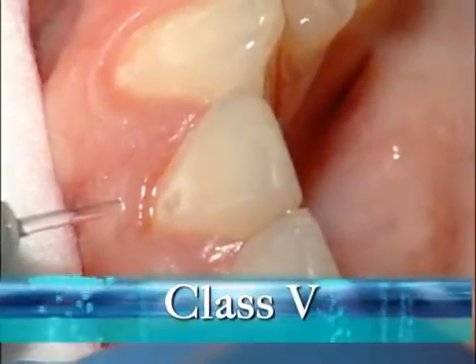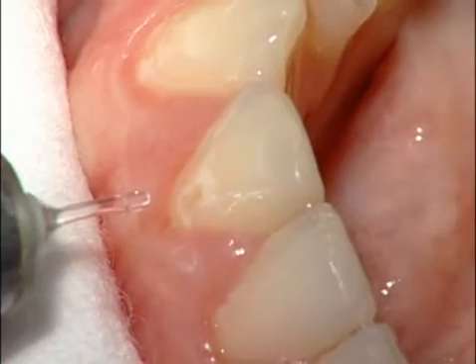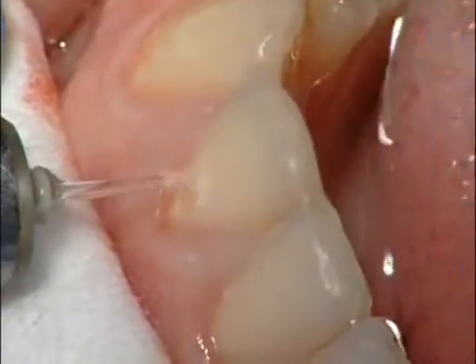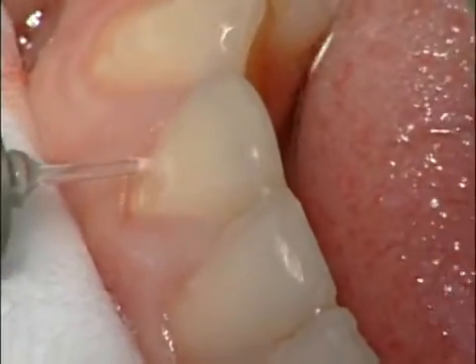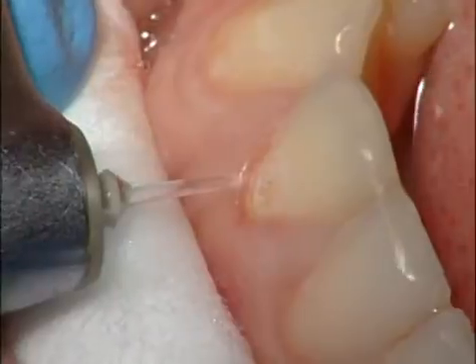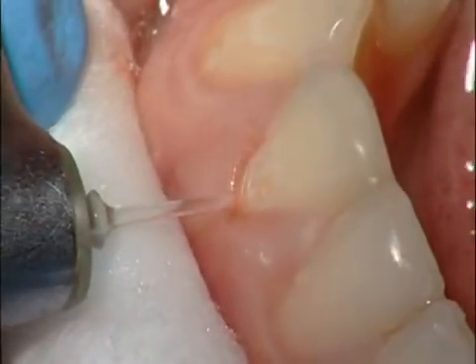Here we have a class 5 cavity without an existing composite on a fairly small thin enameled tooth. I would start this at 4 watts at 15 to 30 hertz with a T4 or a G6 tip, 20 to 50% water and 70% air. A cavity like this is not going to take you much time. This is a 20 to 30 second procedure normally.